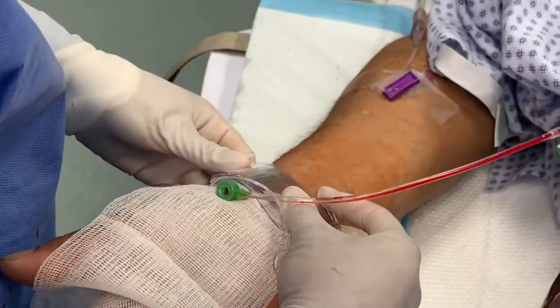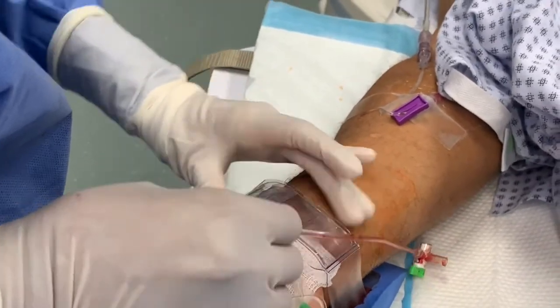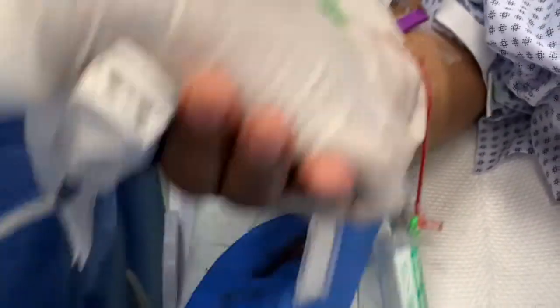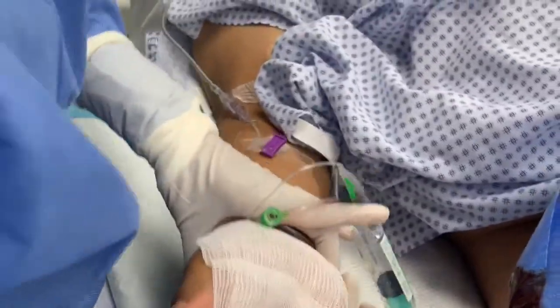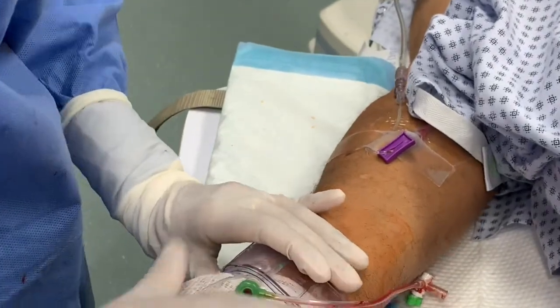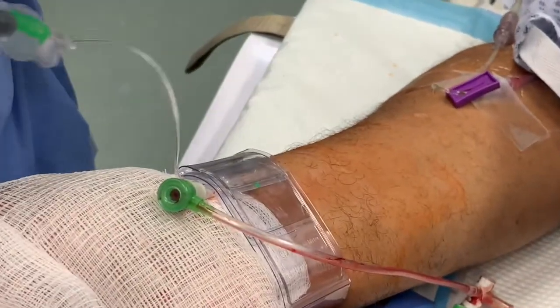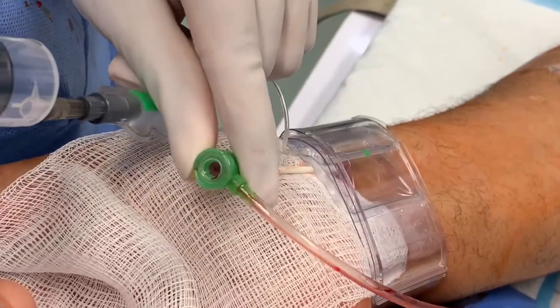Here is the device being placed on a sheath that is slightly withdrawn. The device is fastened using its Velcro-type strap. The syringe is attached with approximately 17 mils of air within it, and gently the air is inserted as the sheath is slowly withdrawn.